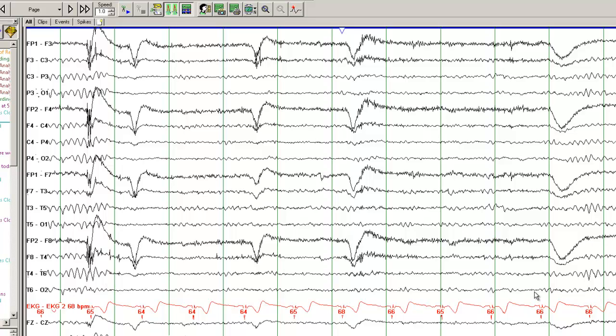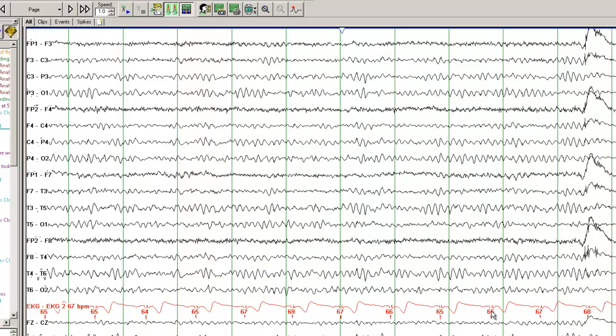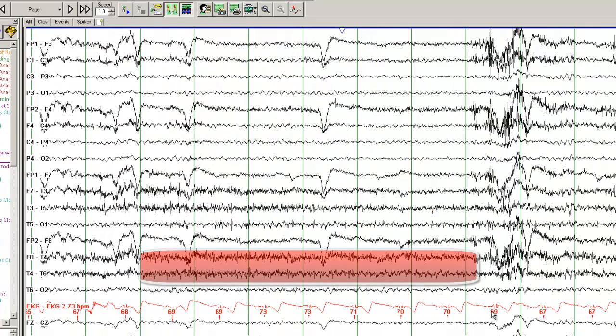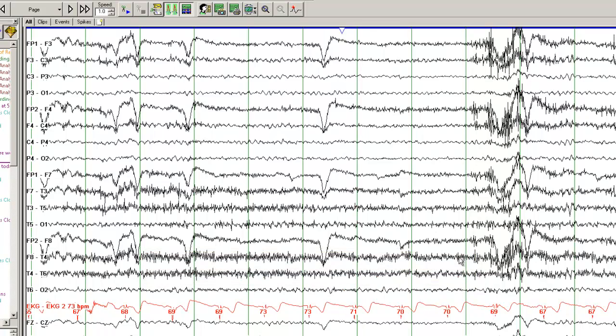So when you describe this EEG, you can say that the EEG demonstrated a well-developed posterior dominant alpha rhythm, which was reactive to eye opening and closing. If we continue watching this EEG, you will also be able to appreciate that there is some muscle artifact over here. This fast frequency here, this is muscle artifact, and the fast frequency that overlays most of this record, this is beta frequency.